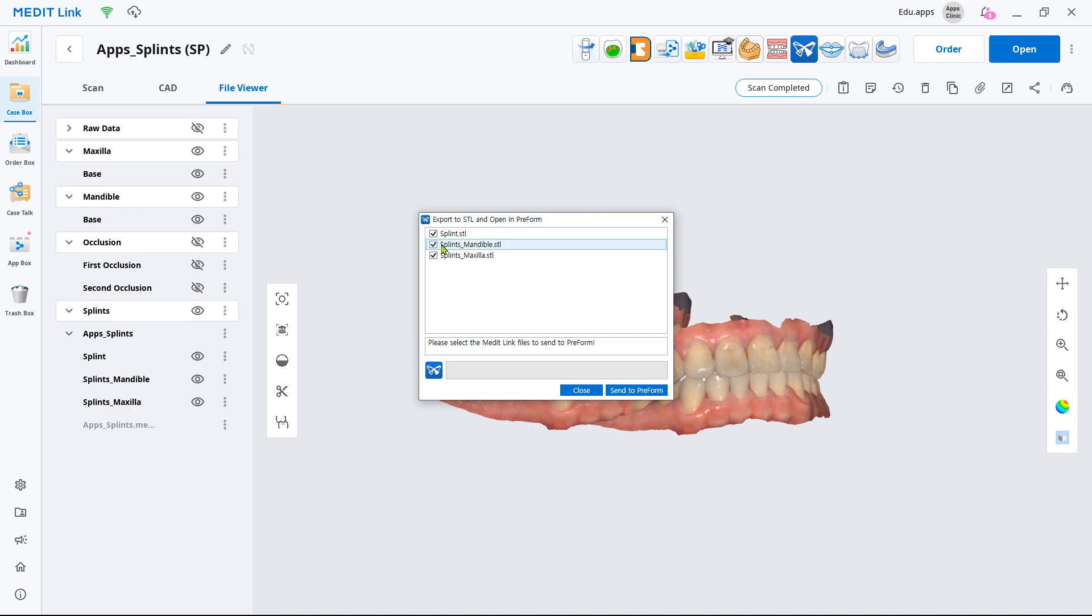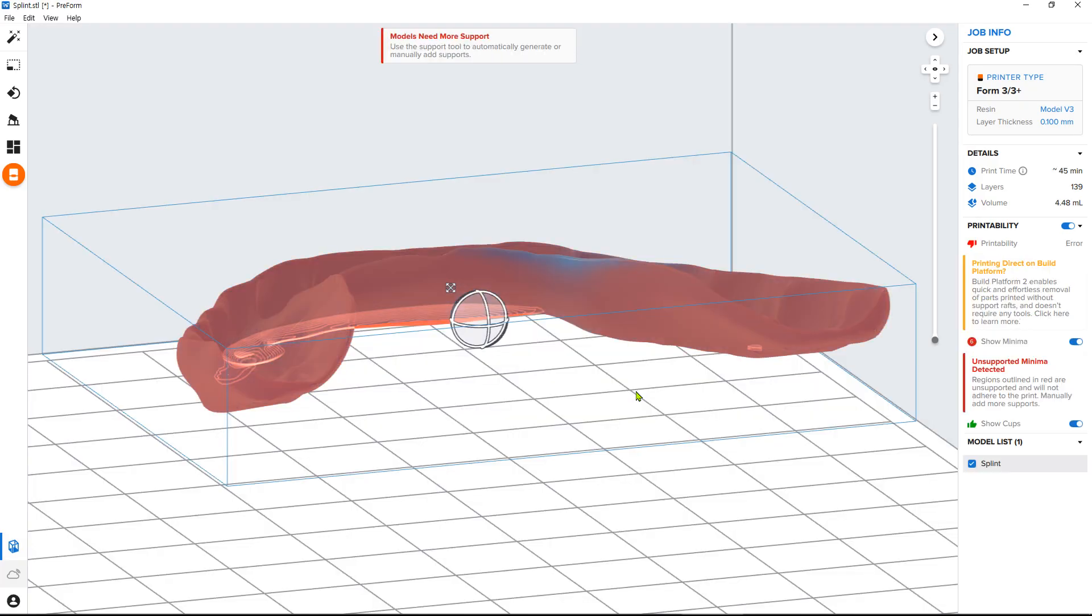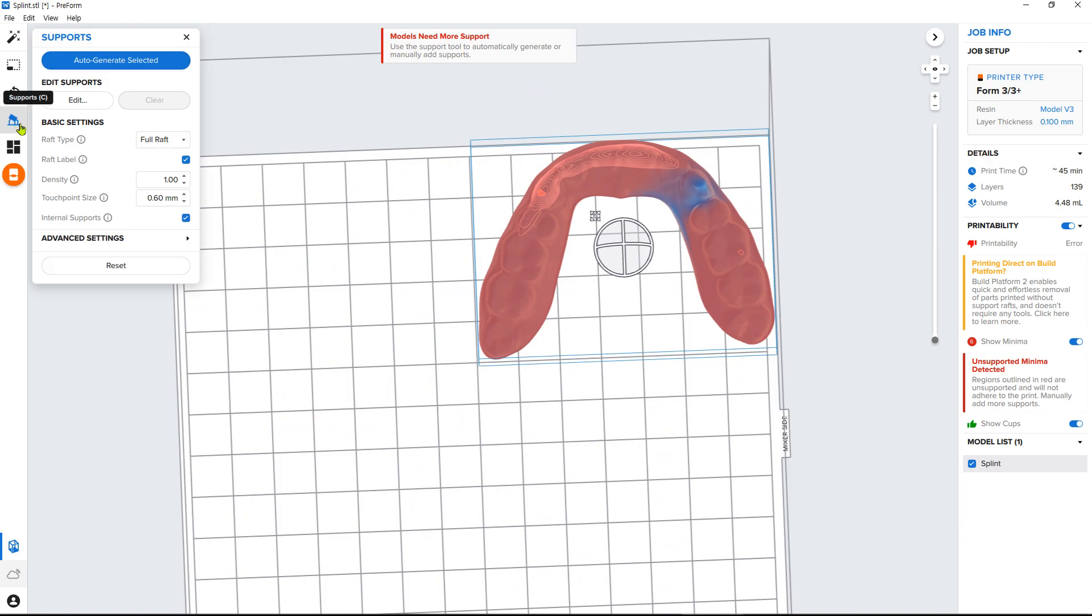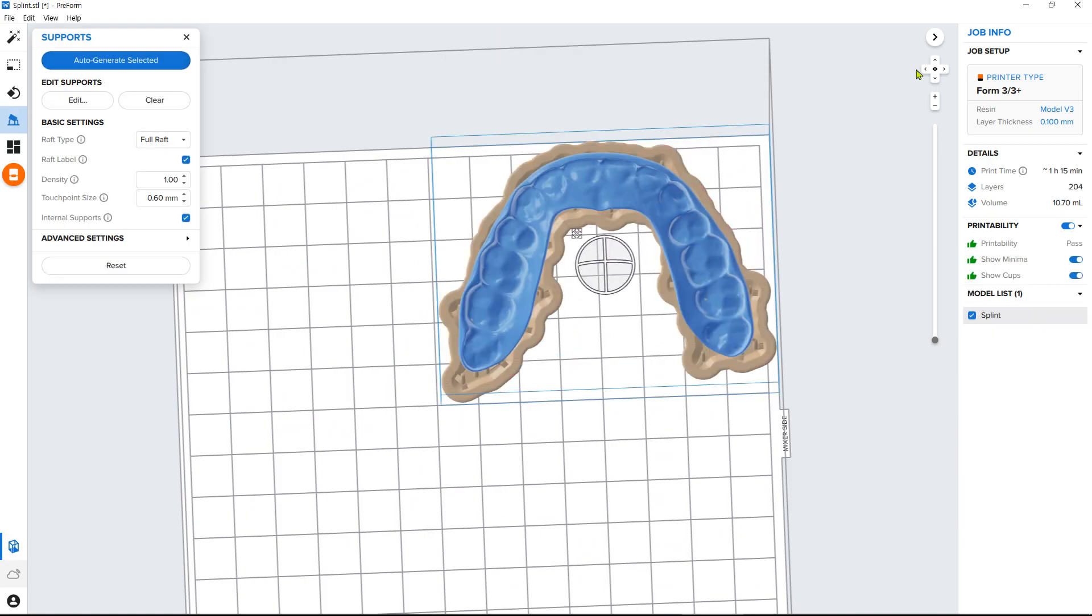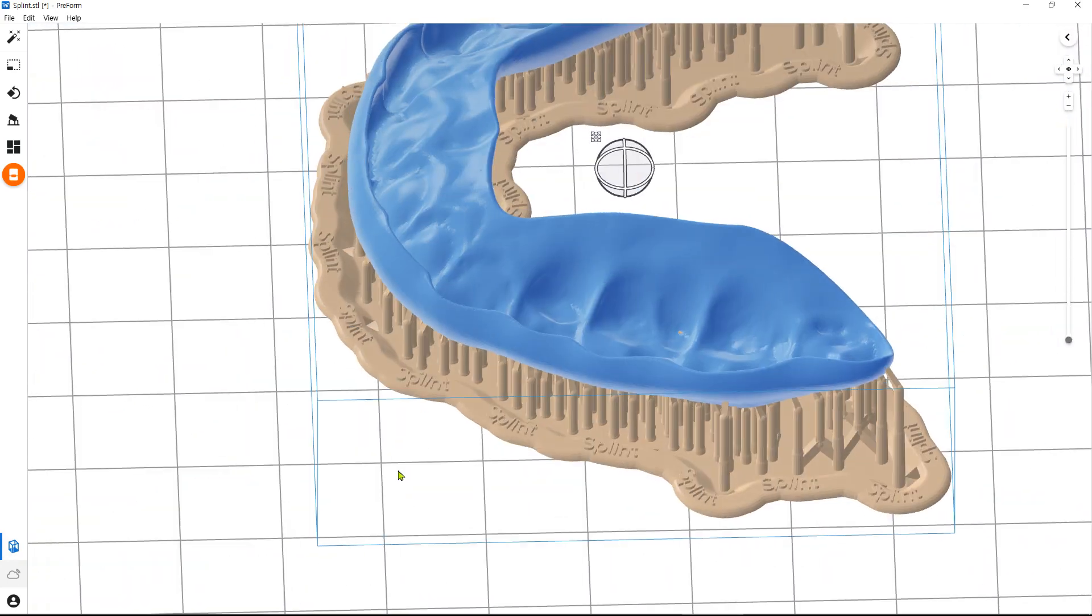Now you have a 3D printable splint. If you are using a 3D printer from one of our partners, you can export the splint file directly to their software from Medit Link and make the final preparations before printing.